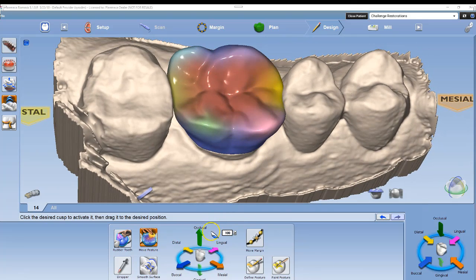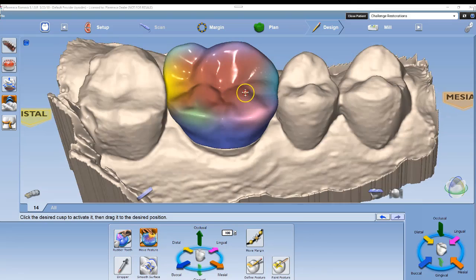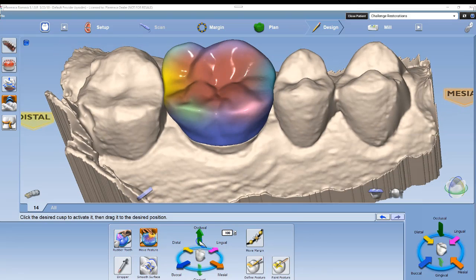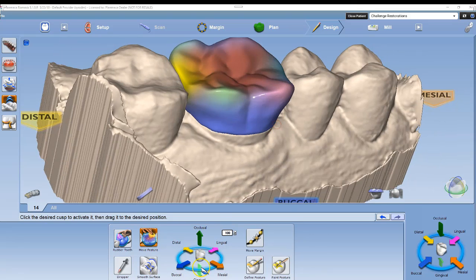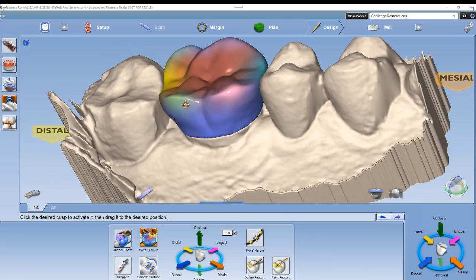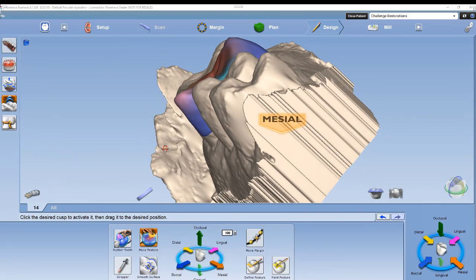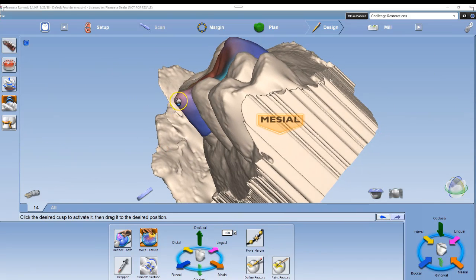Now that we know how it works, let's try to apply it. I can use it to adjust the marginal ridges up or down by left-clicking the gingival or occlusal arrow.